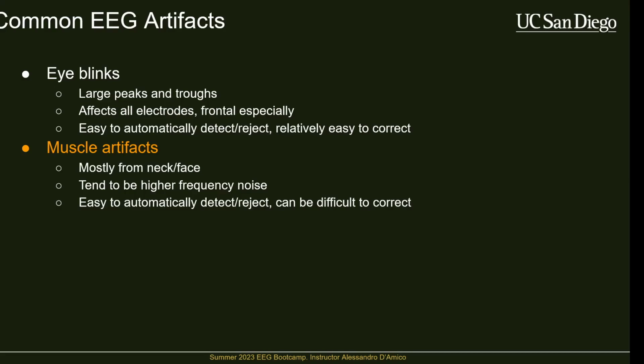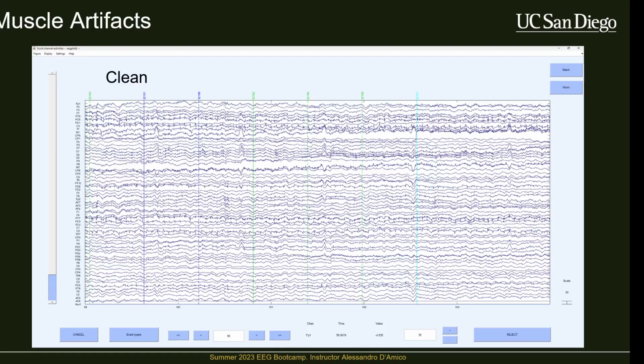Another massive class of them are muscle artifacts, and we're mostly getting these from our neck and our facial muscles, which are quite large and are very close to our sensors that we're recording from. And these also have a set of things you can do to make things better or remove or detect. So just to give an example of what these look like in EEG data, this is some raw EEG data. It's been high pass filtered so that we can essentially keep it all on a straight line. I'll explain why that happens when we do analysis. But here are 64 channels of EEG data, and this is a pretty clean section of data.